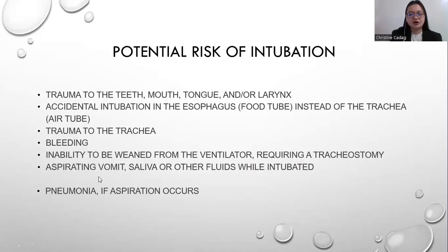It is usually common among patients who are in a vegetative state and those who are bedridden. Next is aspirating vomit, saliva, or other fluids while intubated.